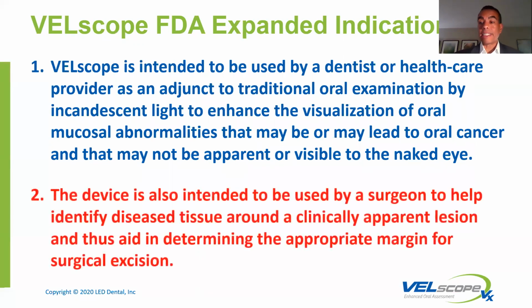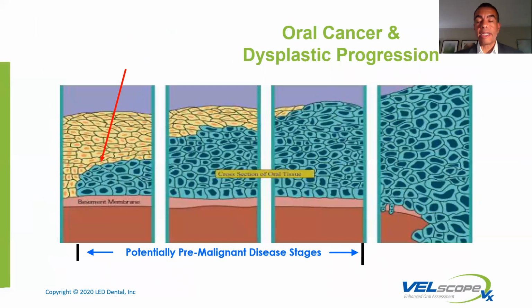But it's actually geared for people like us that do a thorough oral health exam on a regular basis. And it's so effective. This is used by oral surgeons to assist in identifying changes. This actually comes from the medical industry, where it's used for lung cancer screening. So you can inform them this has been in medical applications for almost 20 years. At the end of the day, though, your goal is to find things early.